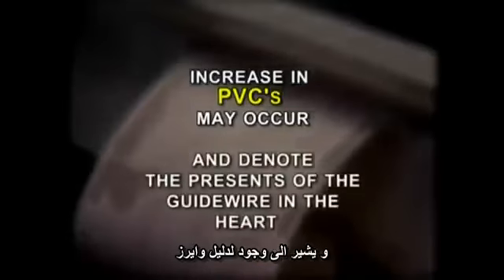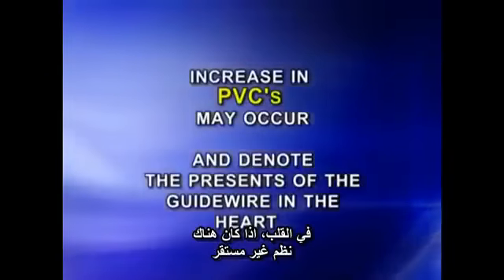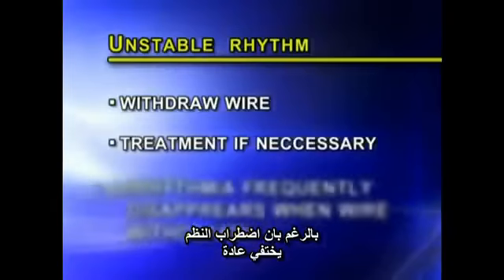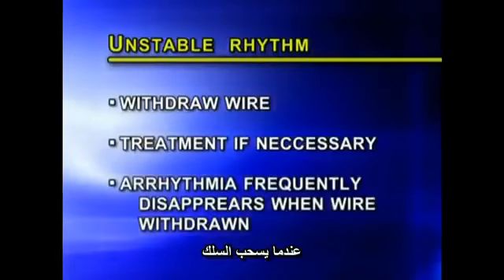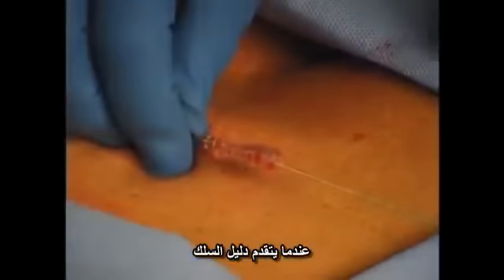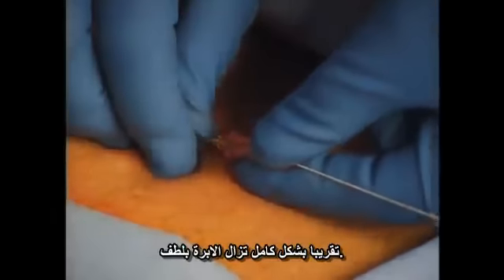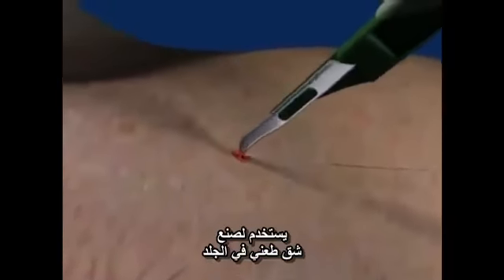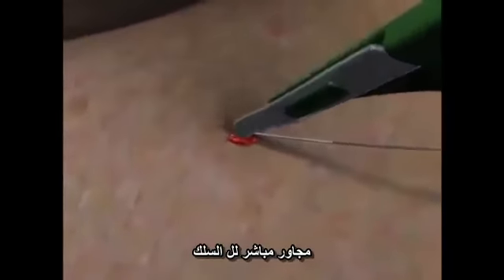An increase in PVCs may occur and denote the presence of the guide wire in the heart. If an unstable rhythm should develop, the wire should be immediately withdrawn and treatment instituted if necessary, although the arrhythmia frequently disappears when the wire is withdrawn. Once the guide wire has been advanced almost completely, the needle is carefully removed. A number 11 scalpel is then used to make a stab incision in the skin immediately adjacent to the wire.